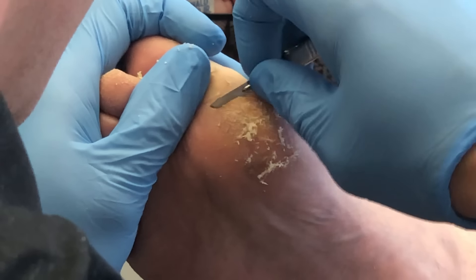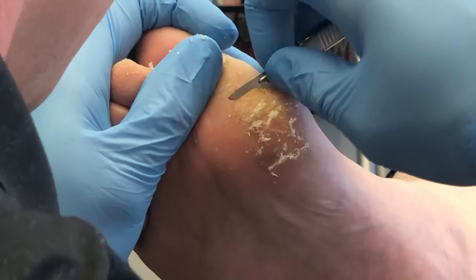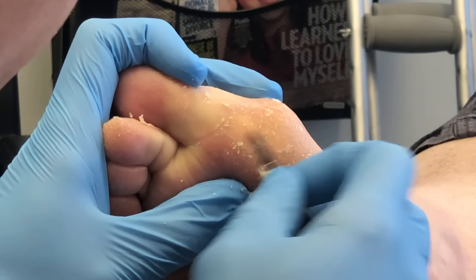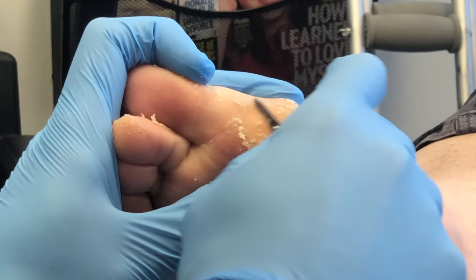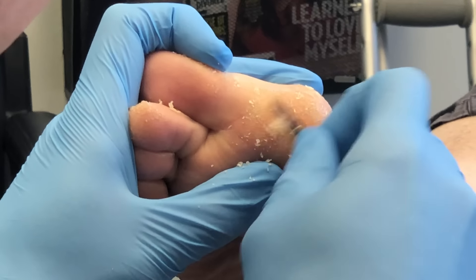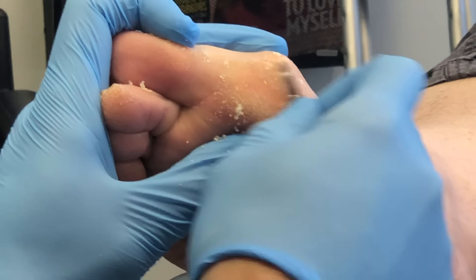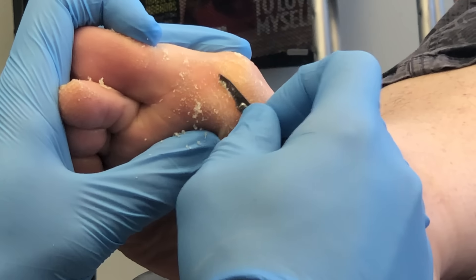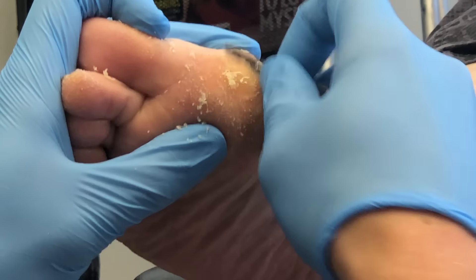With taking off all that tissue, you'll notice a little bit of fissuring in the callused skin. Dead callus skin is not as elastic as healthy tissue, which leads to cracking and ultimately fissuring — meaning a crack in the skin that can open and bleed. That's why you want to take some of that tissue down to allow the elasticity to return to the skin.